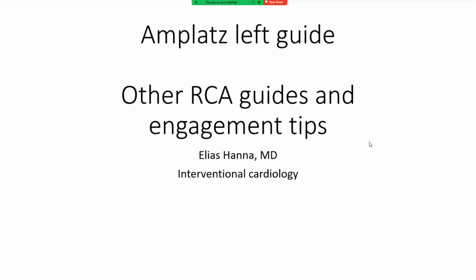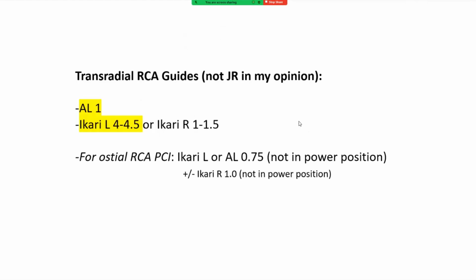I want to talk today about how to maneuver and engage the Amplatz Left guide, and I will describe as well other RCA guides and engagement tips. I suggest that you review, under my playlist cardiac catheterization techniques, several other videos I provided about engagement techniques, whether for the right coronary, left coronary, and for grafts.